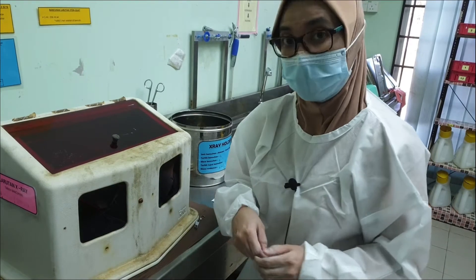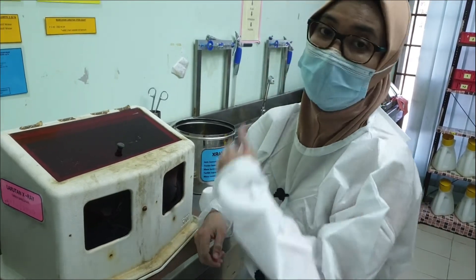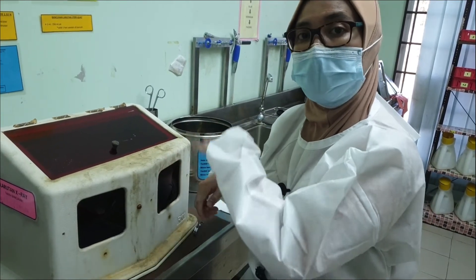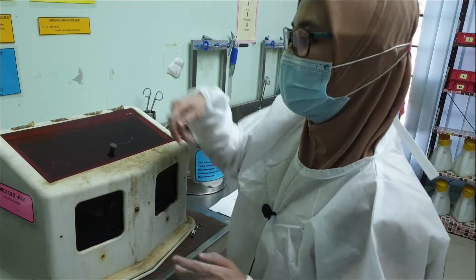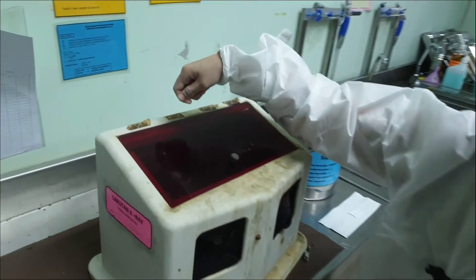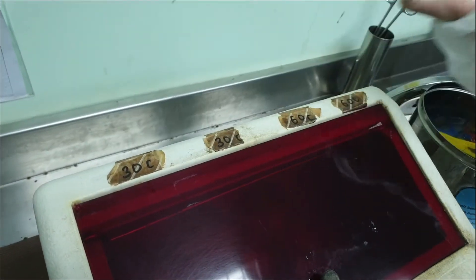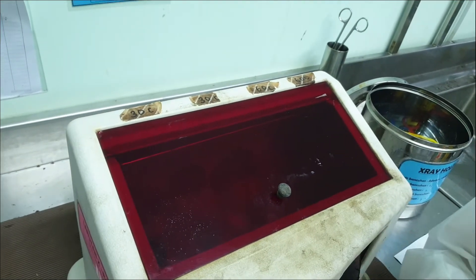Then you will put your x-ray film in the container containing the fixer for 60 seconds. After 60 seconds, wash it with water placed next to the fixer container. Don't worry about the timing because they have already placed a label on the box to remind you how long you should place your x-ray film in each container.